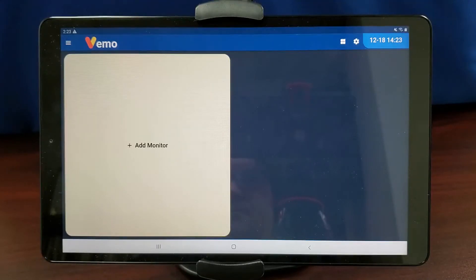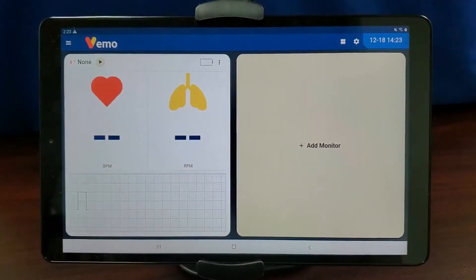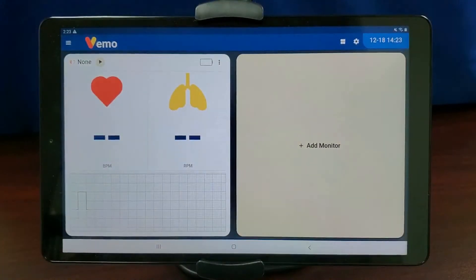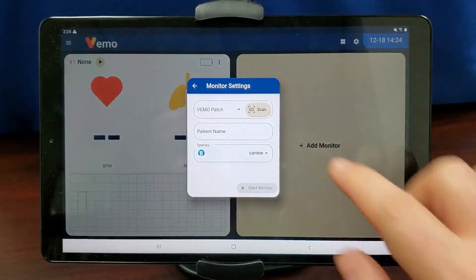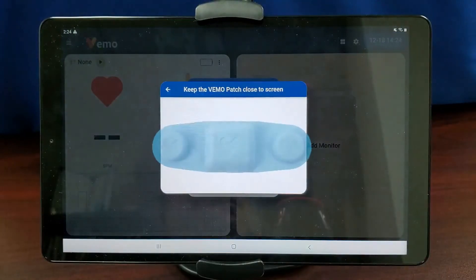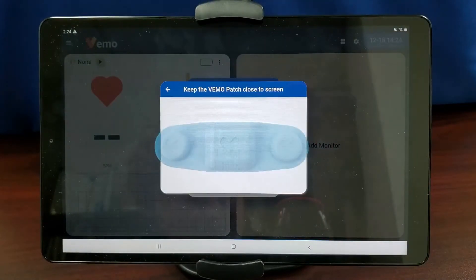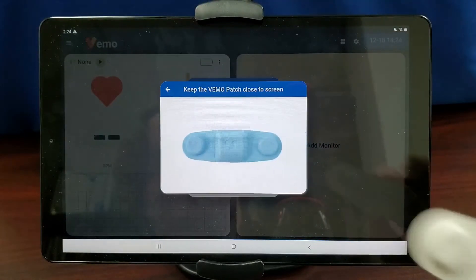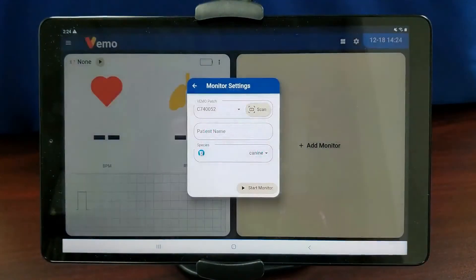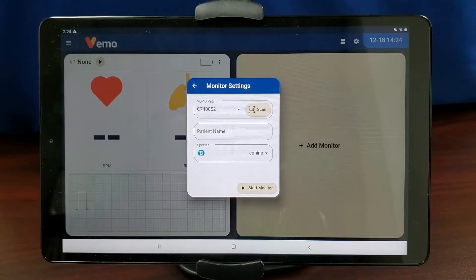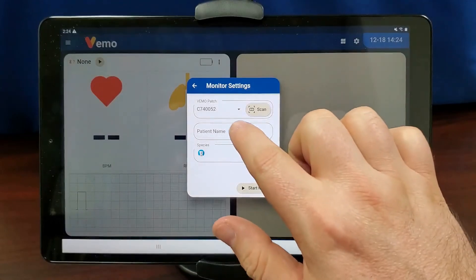Tap Plus Add Monitor. Tap the Play icon. Press the Scan button from the monitor settings. Hold the Vemo sensor against the screen. Follow the directions. It may ask you to put the Vemo sensor closer to the screen, or it may ask you to move the Vemo sensor away from the screen. When it is successfully connected, it will say Done on the screen.